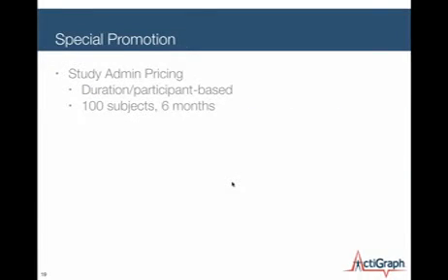Raw data uploads is high on our priority list, and so today you do have to have the device in hand to get the raw data. Coming in Q1, that data will automatically be uploaded to the study admin system, and as you can imagine, there are some logistical challenges with that data because of the magnitude and size of it. And so we're working through some techniques to solve that problem in low bandwidth sites. And so that data will then be available, and as I've mentioned here in this bullet, exportable to a number of formats, and SPSS being one of those.